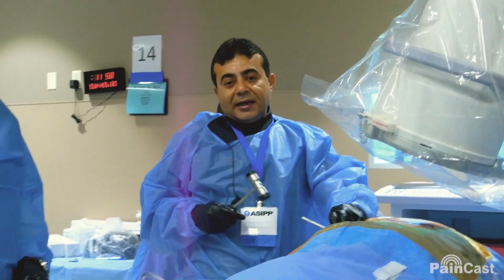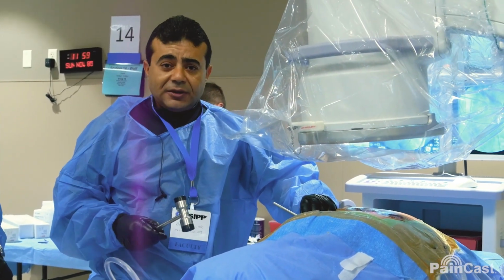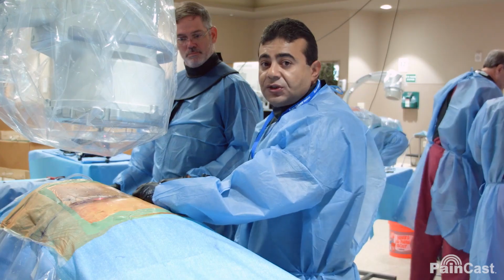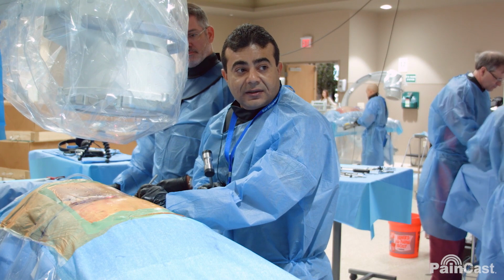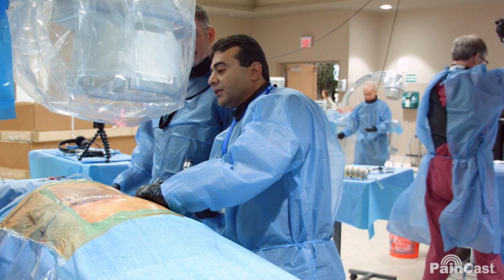So that is the inside-outside technique. I encourage everybody to do the inside-outside technique first because it's the simplest, it's the safest, and then as you do more cases, you go on to others. So here it is, perfect. We see we are already inside the disc a little bit, and we have not crossed the medial pedicular line. Okay, we can go lateral now.